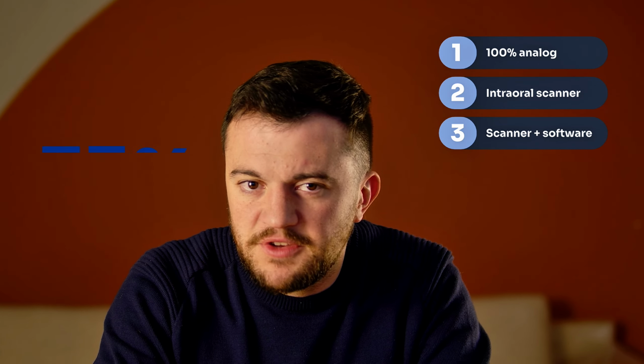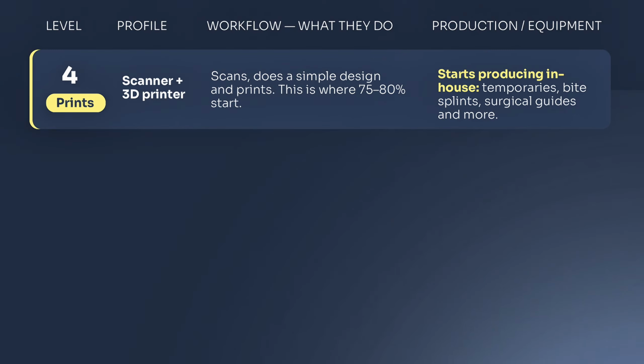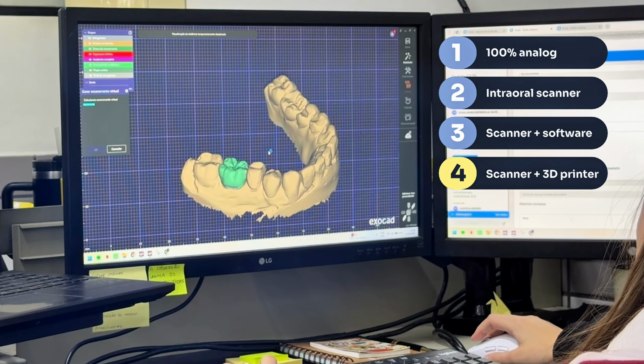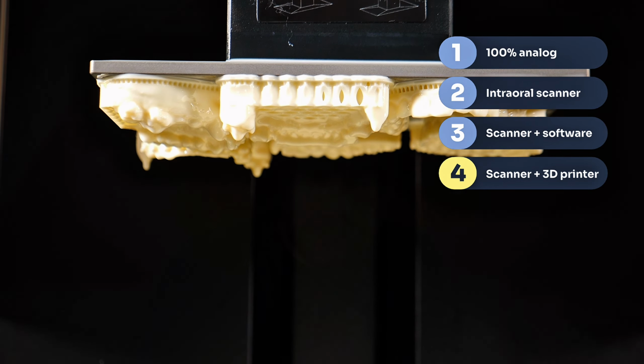What would be number 4? I think most doctors that are getting into digital dentistry, I'm going to guess a number here, I'm just going to say like 75-80%, are starting here. It is the doctor that scans, does a simple design, and is printing. SprintRay has done a great job with the Midas. Now we have the new shiny 3D printers, the ones that are really small, focused on single crowns.